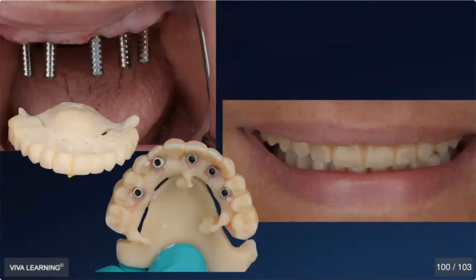You can use these techniques to create hybrid prosthetics. This is one that we 3D printed and delivered day of placement. So this patient was edentulous, had a denture, and we did the denture dual scan. And from that, we were able to plan a surgical guide, place implants, and put temporary abutments on the same day.